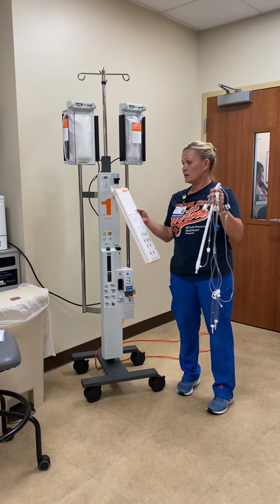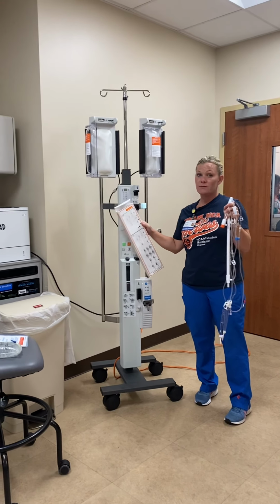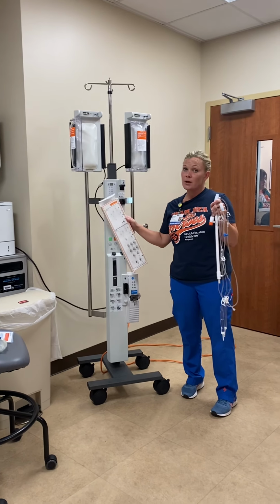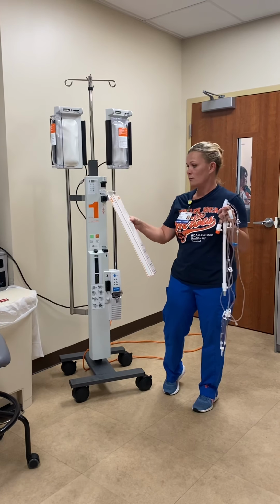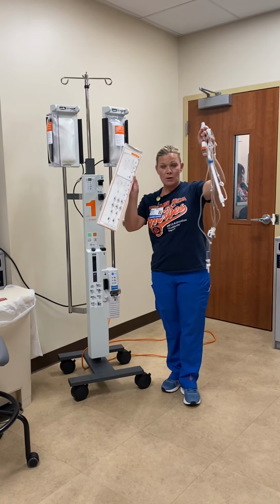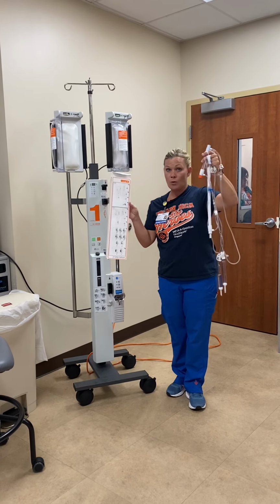Okay, so I'm just gonna cover very quickly how to work the Level 1. This is gonna be your rapid infuser. You can infuse blood, fluids, all of those fun things when you're getting a trauma patient into the trauma room. So first things first, you have to have this type of tubing to run through the Level 1, otherwise it won't work.